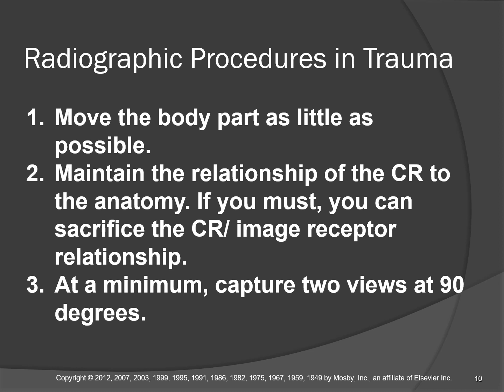Okay? Now, at a minimum, for a trauma exam, imagine the most mangled ankle or foot, you can't even recognize it. It's just like a wad of flesh. There's blood everywhere. You're not sure if the patient has all their skin. Muscle is sticking out. It's a mess. It looks like it's been through a meat grinder. You have no idea what a true AP is.